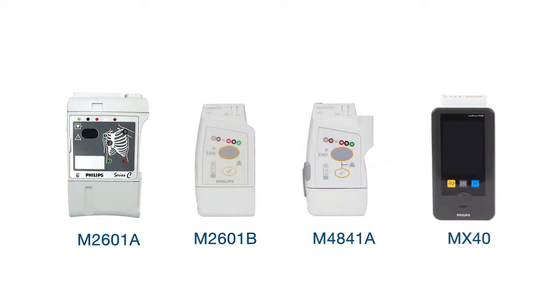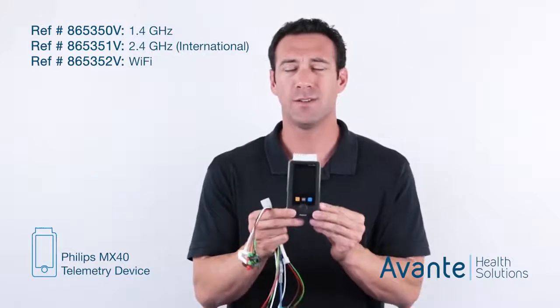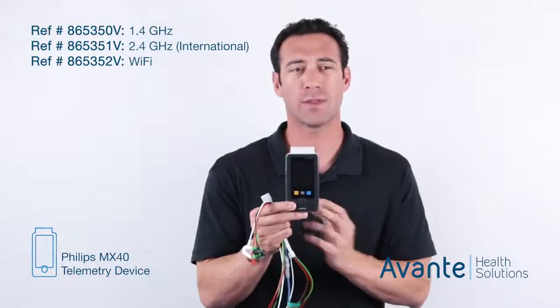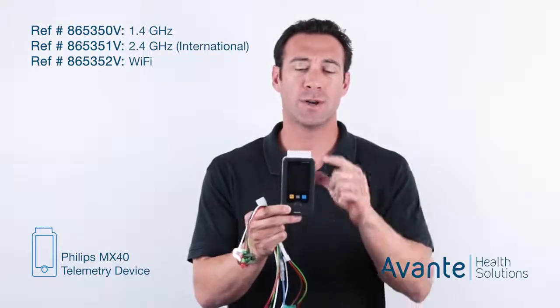This one operates just like the M4841. It operates in the 1.4 gigahertz radio frequency range. In fact, you can run this concurrently with your M4841. You will need a little bit more infrastructure. The MX40 is not as strong. The signal on it is not as strong, mostly due to the fact that the batteries have shrunk, and there are other portions of the unit, mostly the screen, that take the power away. But it can be run simultaneously.